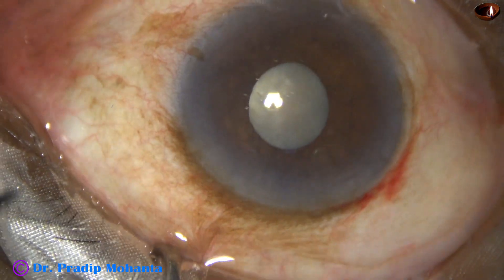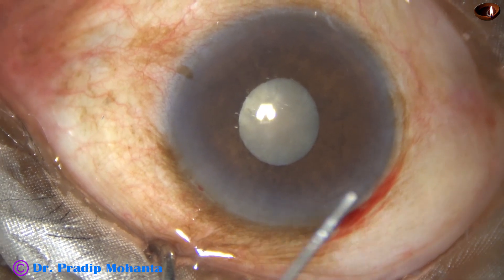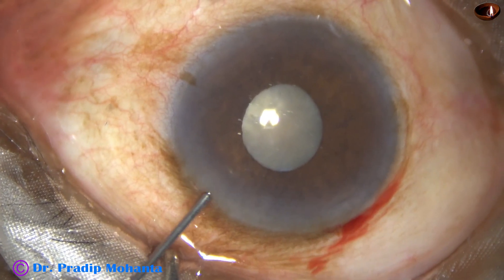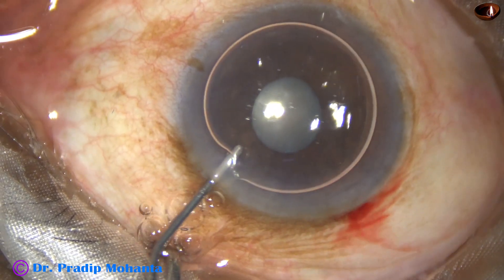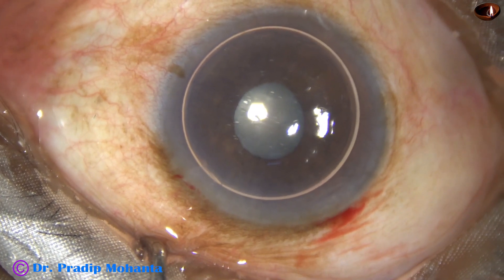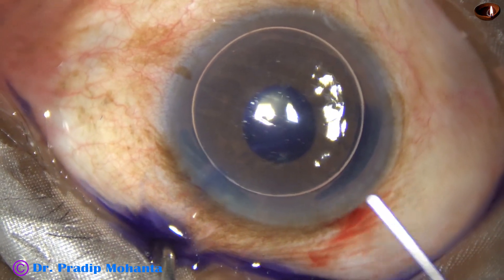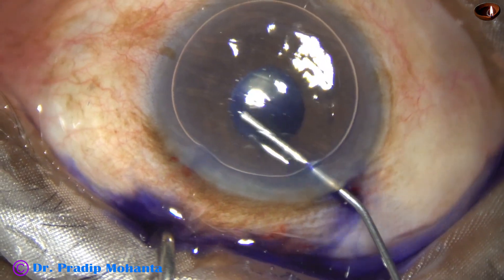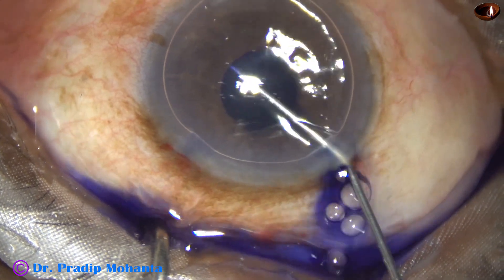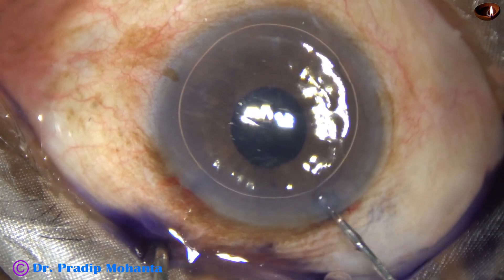The main incision has been made. A side port has been made on the left side of the main incision. Now I want to stain the anterior capsule underneath this air bubble. We must inject some dye underneath this iris — not only this part, but we go behind the iris and inject some dye so that there is uniform staining all around.